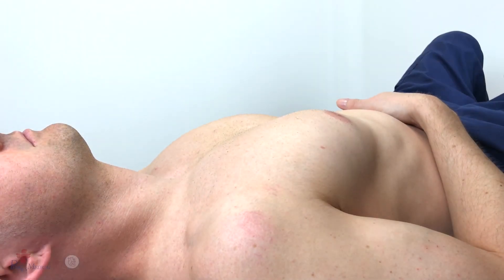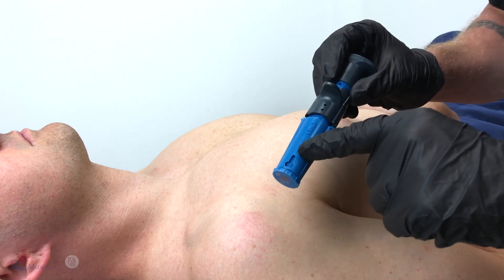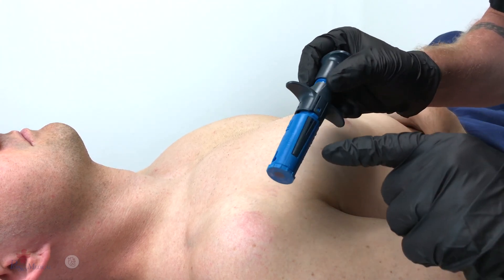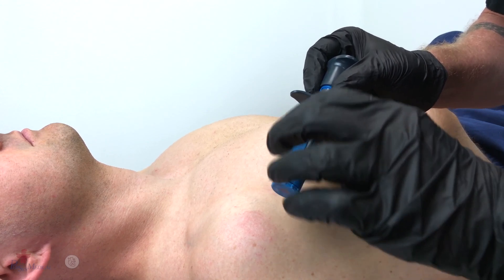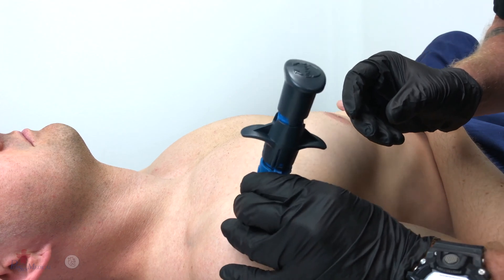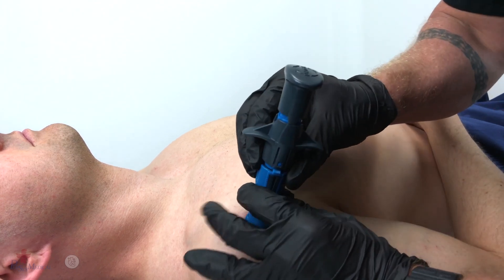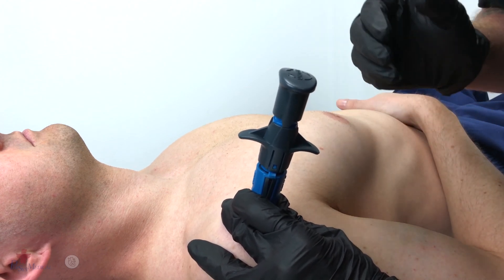Once the insertion site has been located and prepped, grasp the Neo by the texture dots, taking care not to place a finger over the stabilizer locking tabs. Grabbing the texture dots, place the Neo over the insertion site, utilizing the palm and fingers of that hand to stabilize the Neo.